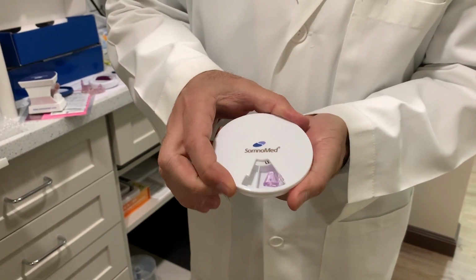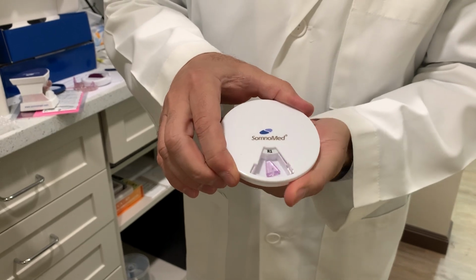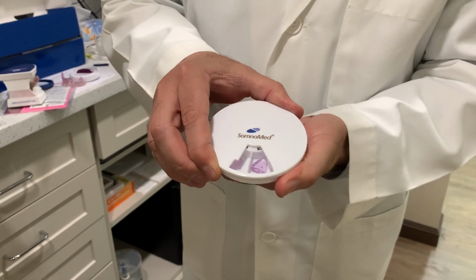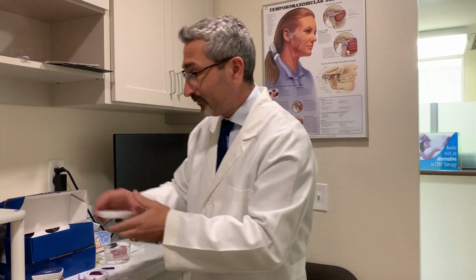If I twist it, holding the top and twisting the bottom, there's L1, left 1, right 1, L2, R2, L3, R3. So what happens is, every time you move up one number, the jaw moves forward 1 millimeter.